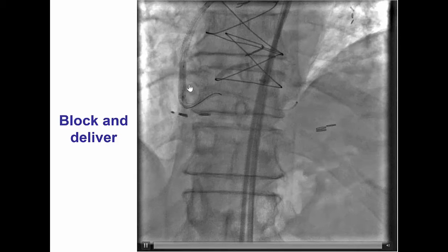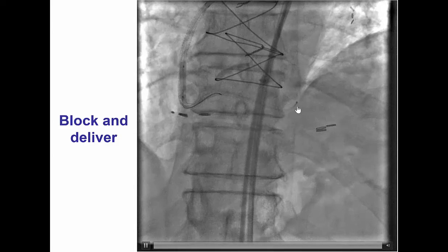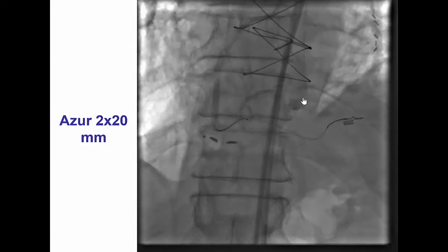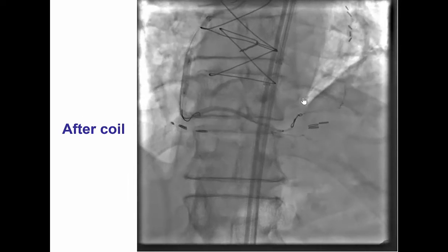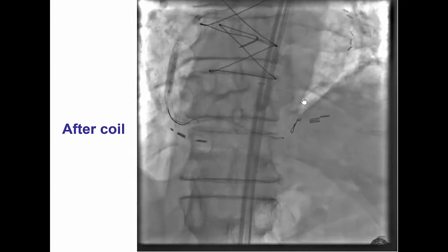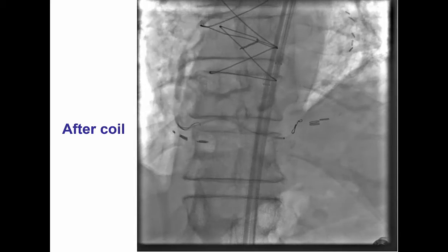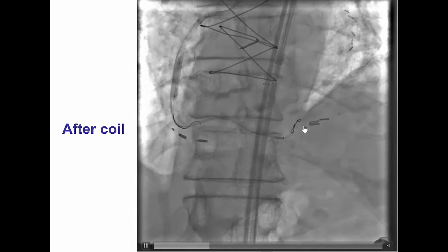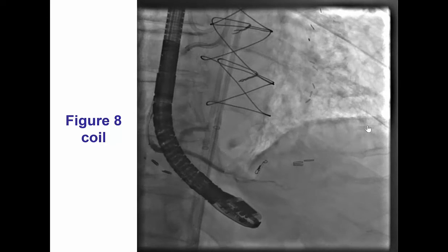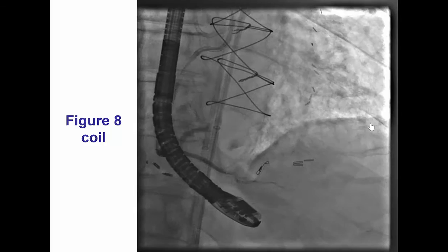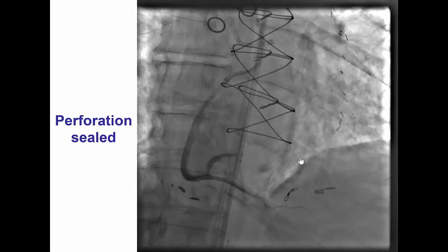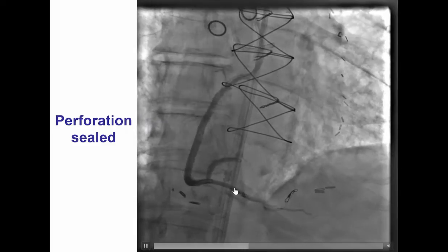We used the block and delivery technique — a balloon inflated more proximally to stop flow in the distal RCA, and then advanced a microcatheter. This was a 0.018 antegrade microcatheter into the perforated vessel. Then, using the Azure 2×20 mm coil, which did not quite seal the perforation initially — noting that Azure coils have a hydrophilic polymer that swells after a few minutes to help cover the perforation — another small coil was delivered, leading to further decrease in flow. A third coil was delivered as well, which ended up backing out more proximally in the posterior descending artery, and the perforation was sealed.